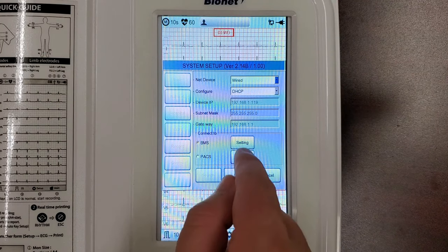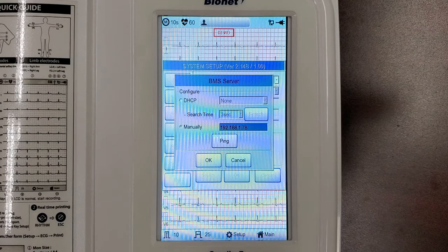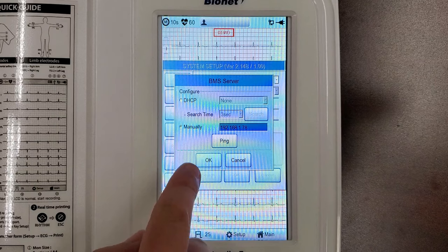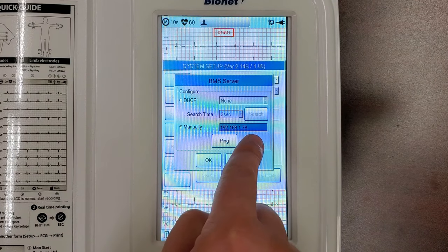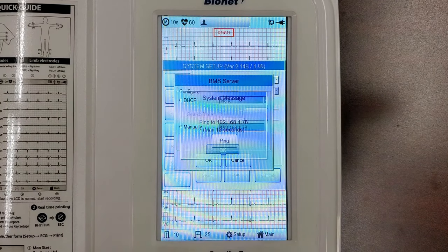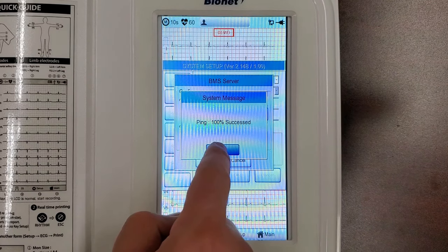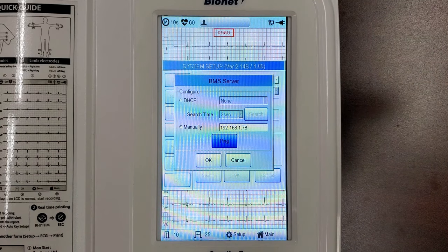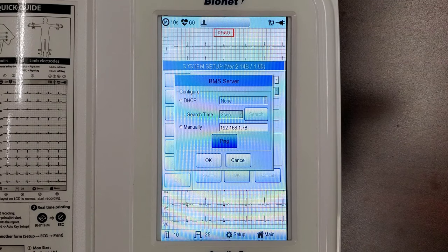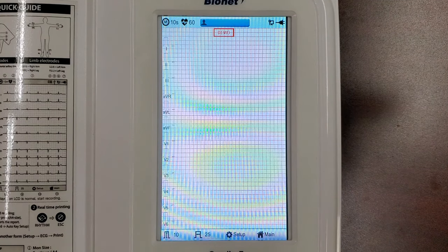Now, click the Setting button next to BMS, and you will find a space to define the receiving computer. Click Manually and input your computer's IP address from the start of this video. Once this is complete, hit Ping to test the connection to your computer. The message should say Ping 100% Success. If your Cardio 7 cannot properly ping your computer, you may need to have a network administrator enter your network data manually in the network screen.